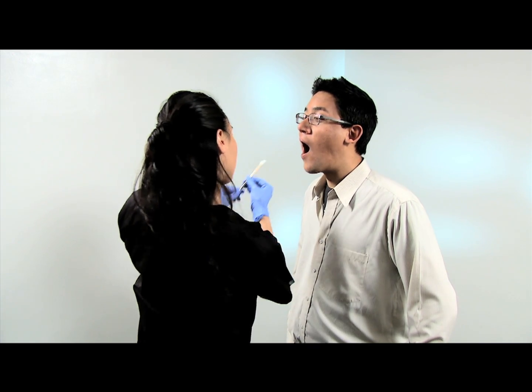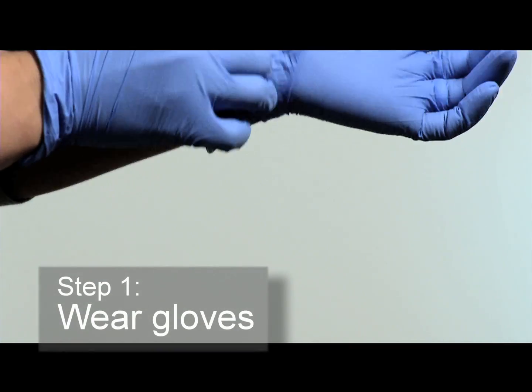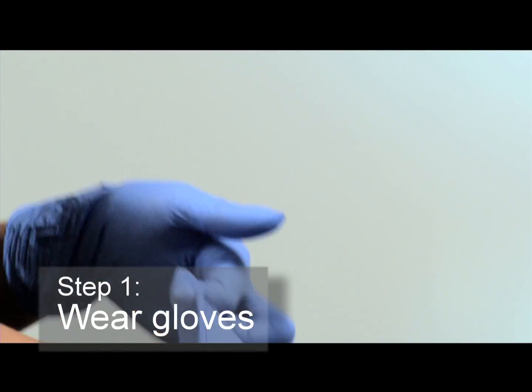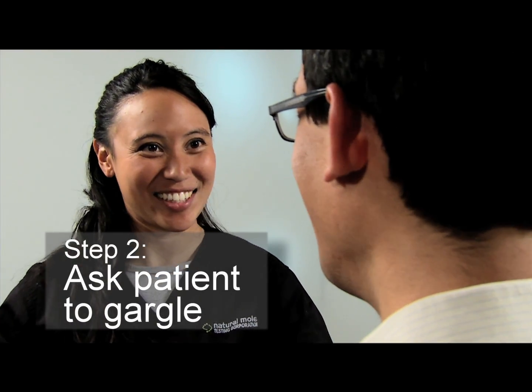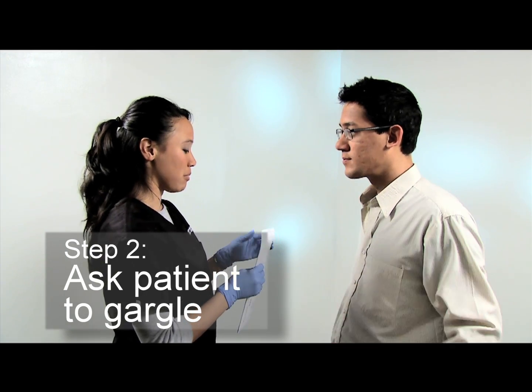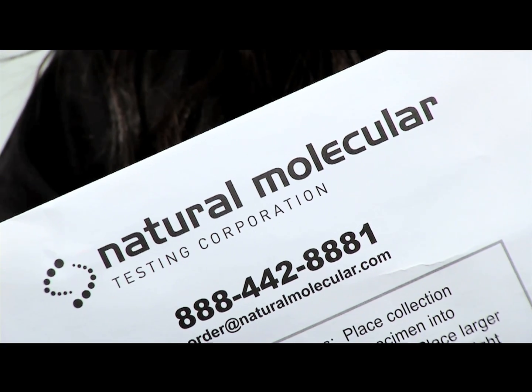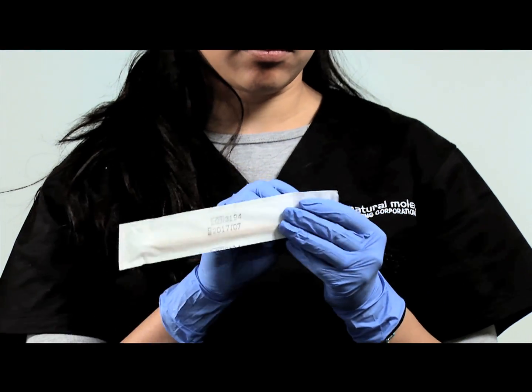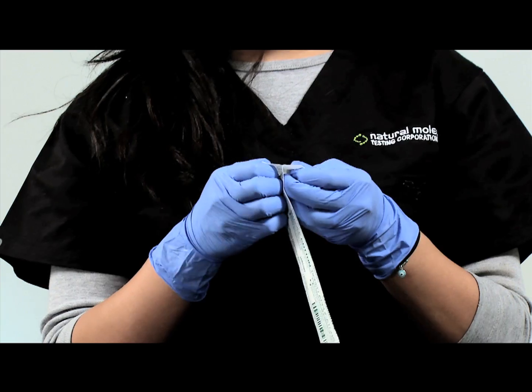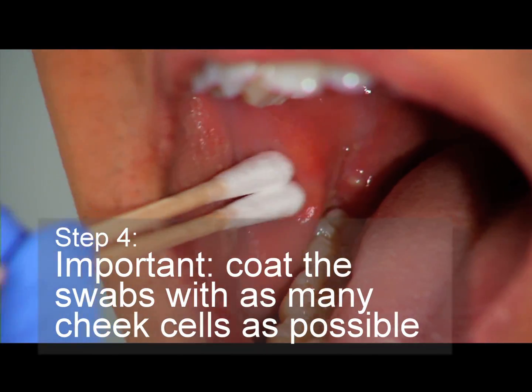That's why following these simple step-by-step instructions is important. Step 1: always wear gloves. Step 2: ask the patient to rinse and gargle with water or mouthwash to remove food particles and other matter that may interfere with testing results. Step 3: open the package provided by Natural Molecular Testing and take out one package of swabs.